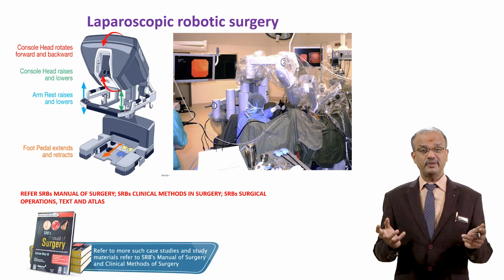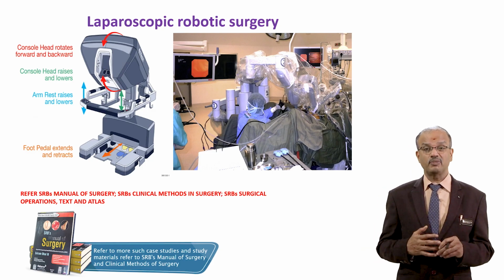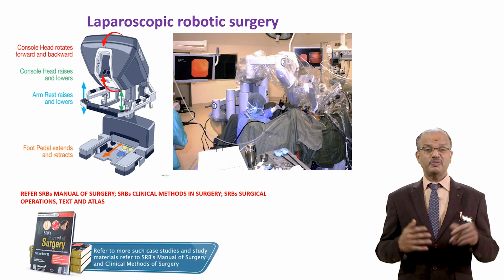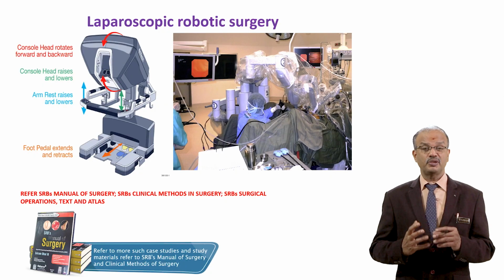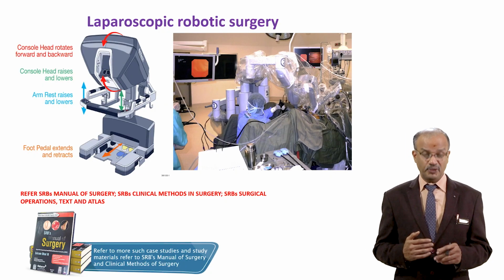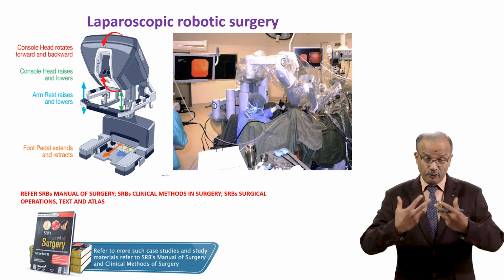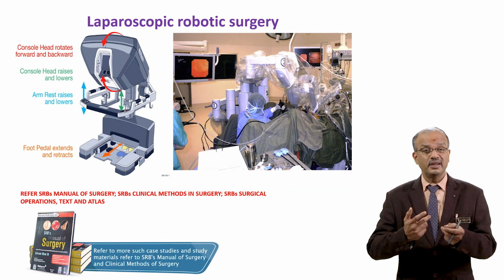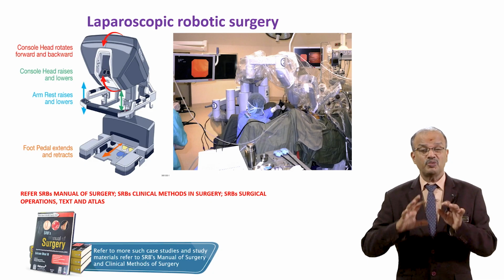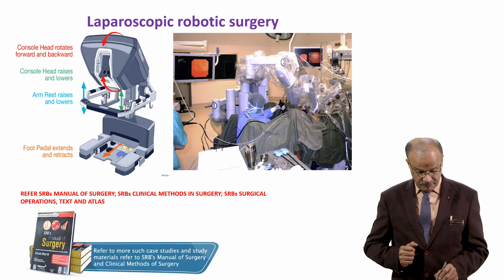So robotic surgery has become the day's trend. You can do surgery very comfortably. High definition, so many instruments are there. With a console, you can sit and do this. It's comfortable for the surgeon and patient also. Quality work you can do in robotic surgery. The movements of the instrument are 360 degrees, so manipulation is very good. Suturing, knotting, dissection will be much easier, proper and specific actually. That is the advantage of robotic surgery.